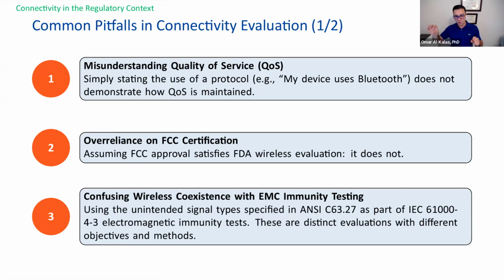And then the wireless technology is a tool that helps you meet that need for connectivity. Just saying I'm using Wi-Fi doesn't actually mean much in terms of quality of service. So please consider what your device is doing and how you're helping your device achieve its intended use.